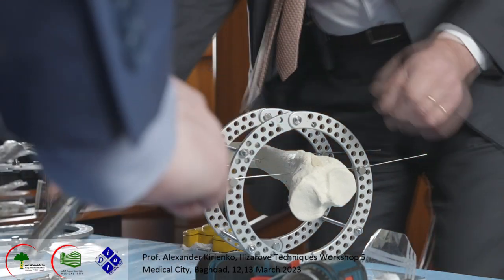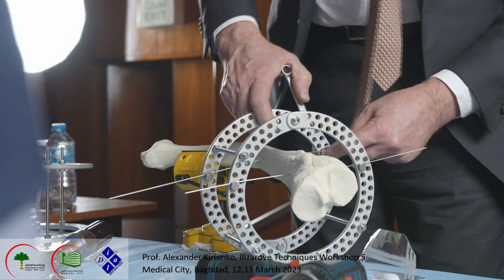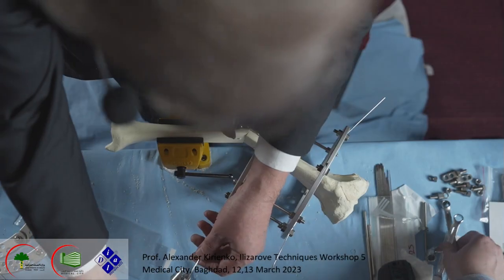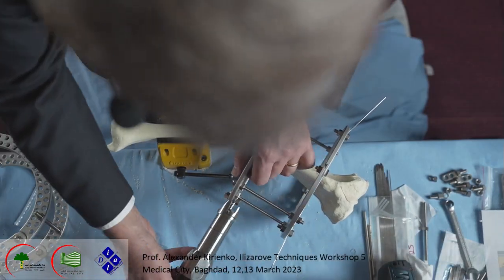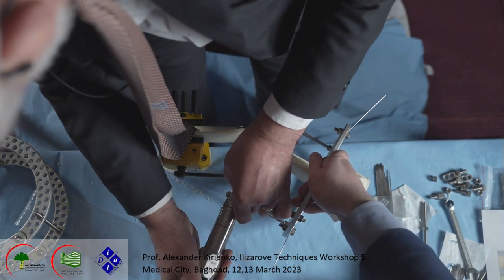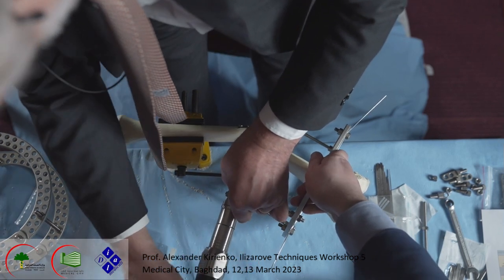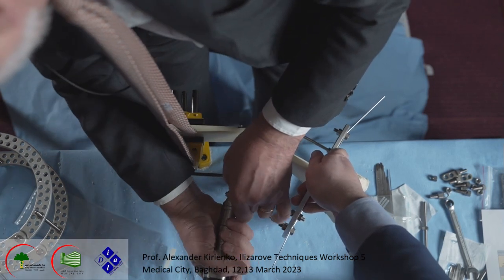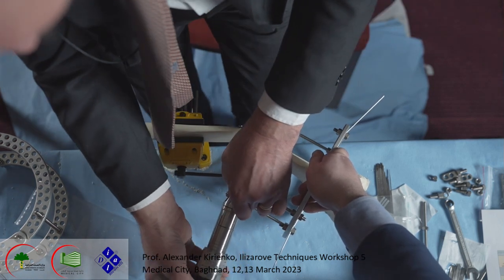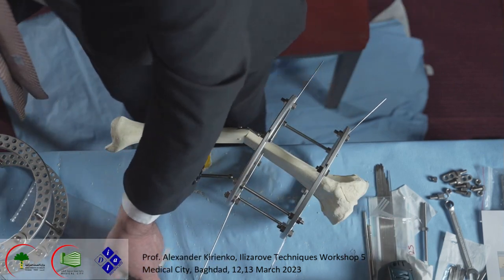Okay, the olive wire should be tensioned from the side opposite the olive, because in this way the olive goes near the bone. Tension this. Or maybe better we do it with the cube. Easy.